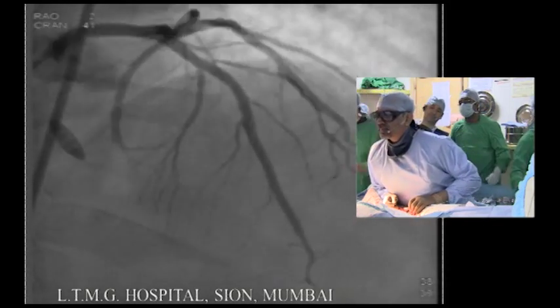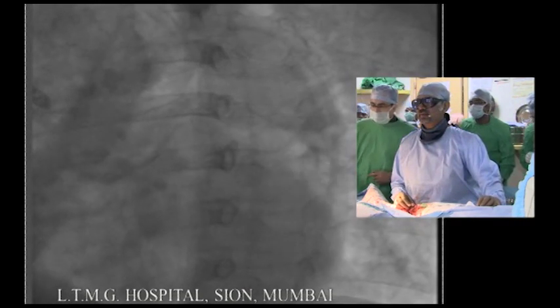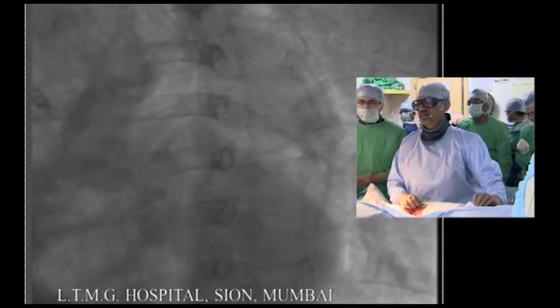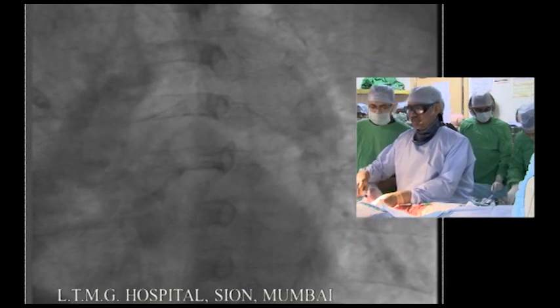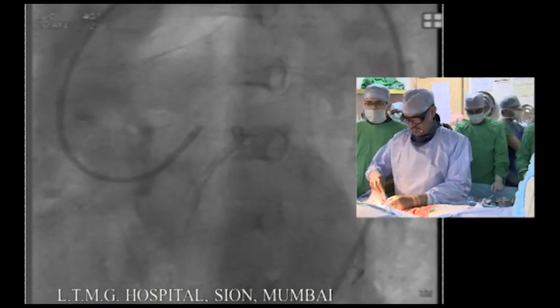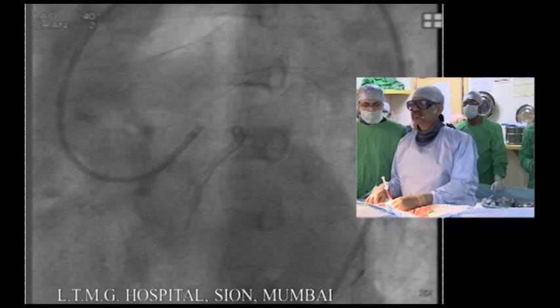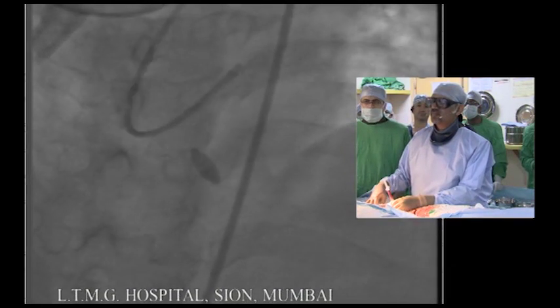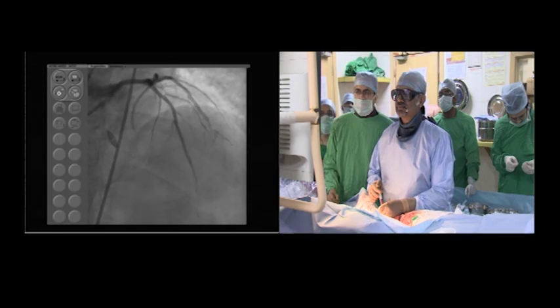Can you take that picture again, focusing more on the distal? Okay, I'll take the picture again. PA cranial. Okay, and show us the distal. Go down distally.